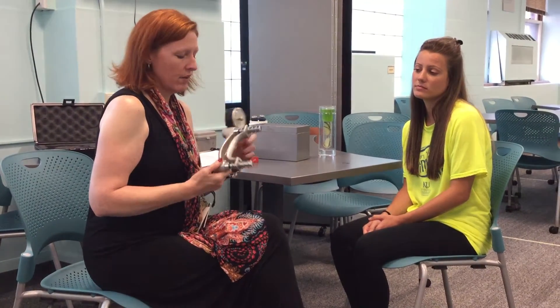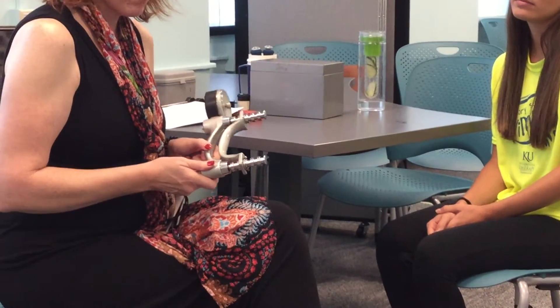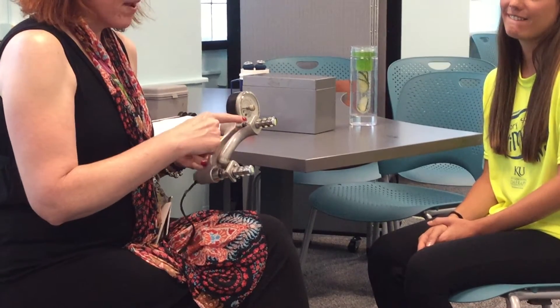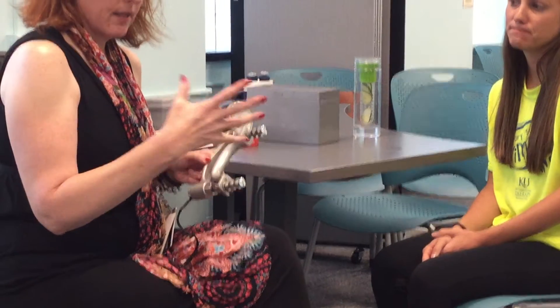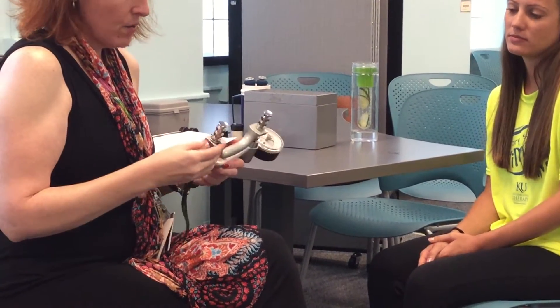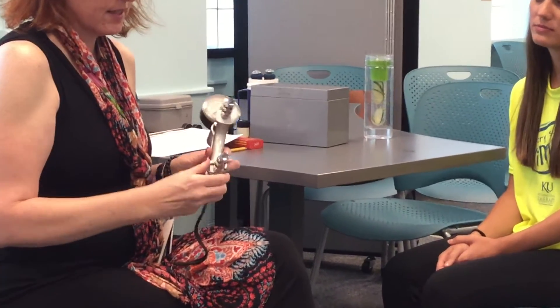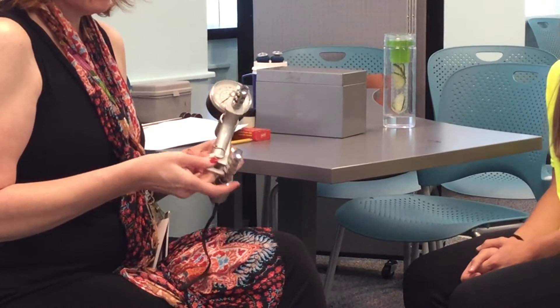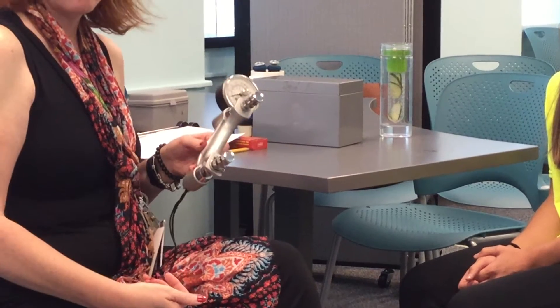The other caveat is you will see that there are five different settings on the dynamometer. For females, you want it on the second setting; males on the third setting because of the hand span. How you basically change settings is this little ring down here — you flip it back, take it out, put it back in, and then just flip it in place.